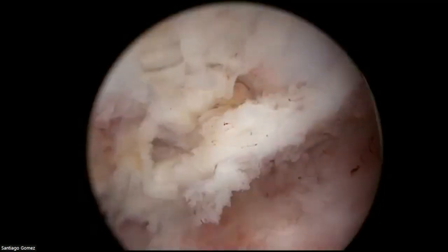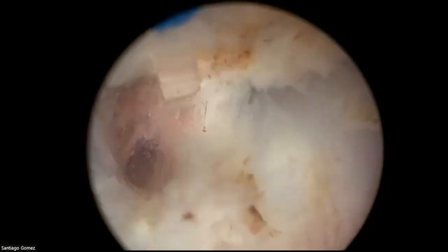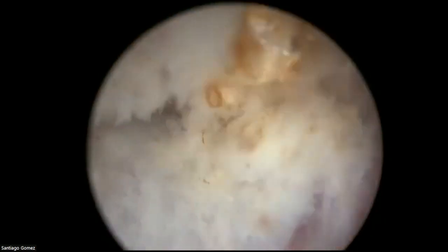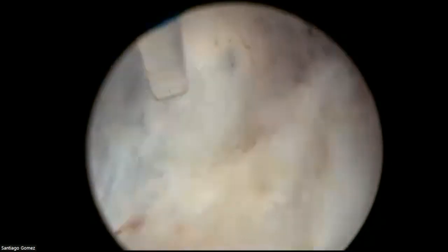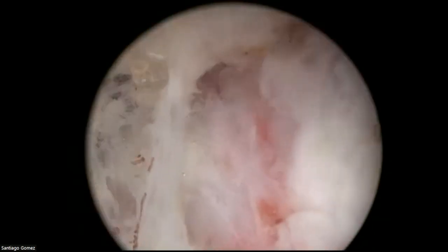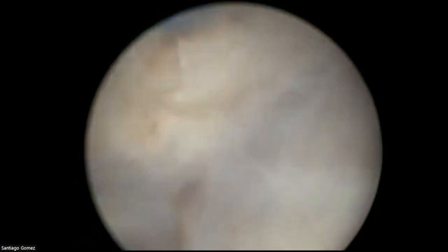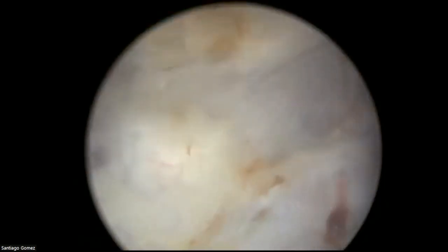Carefully here, let's see, it looks slightly deep there. So when I find that I'm getting deep, of course, I have to correct my aiming. I have to point towards the adenoma, in the side of the adenoma, following my line, but aiming closer to the adenoma, because you see, most of the energy is absorbed by the adenoma. And I managed to separate adenoma and capsule without deepening the capsule.